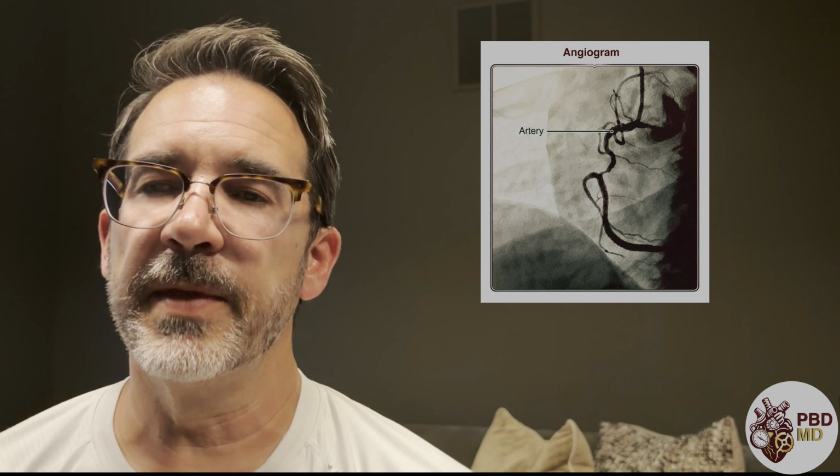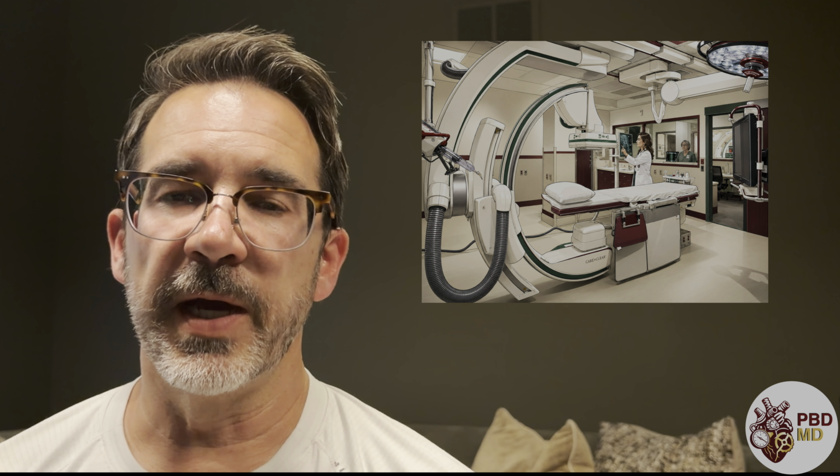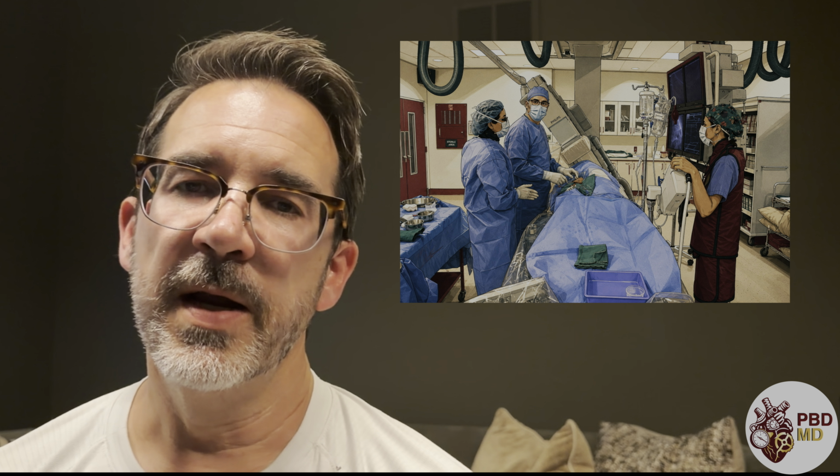I'm Phil Dattilo. I'm an interventional cardiologist. I've got somewhere between 15 and 20 years of work in the cath lab, having done thousands of cases over that time. And I think a lot of times the cath lab remains a bit of a mystery. And so I wanted to make a bit of a video showing how things look in the cath lab. If you are a patient who is planning on having a cath, this may help take away some of the mystery as to what might be going on in there.